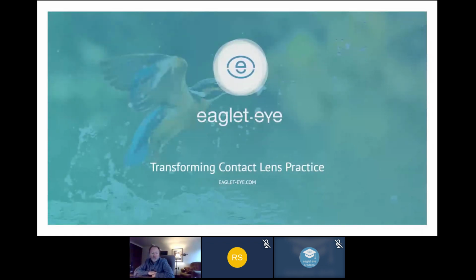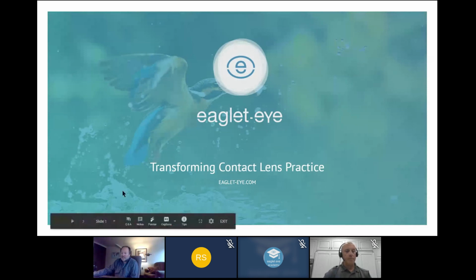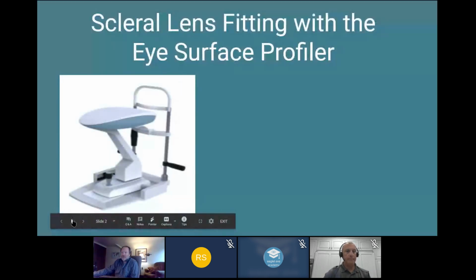We're going to do a demo of the Eaglet Eye Surface Profiler, and we're going to spend about 45 minutes going through stuff. Jump in on the chat line anytime you want, and we'll keep an eye on the chat line and raise your questions when they come through. So let's get her rolling.